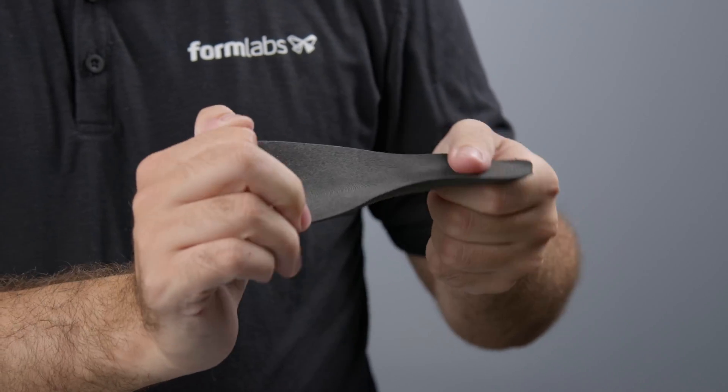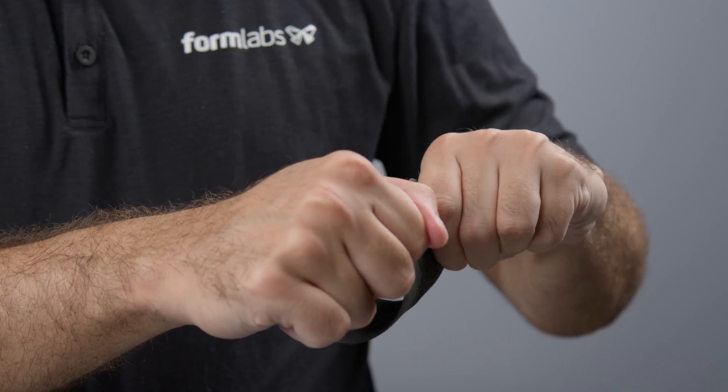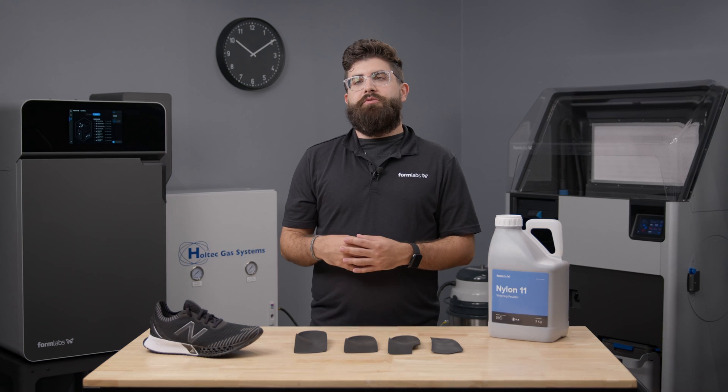When tested alongside insole shells printed on the HP MJF 5200 and CNC-milled insole shells, Nylon 11 Powder performed as well as, or better than, both methods. Whether you're totally new to 3D printing or looking for a more efficient solution in-house, I'm excited to show you Formlabs' validated workflow for producing insole shells.